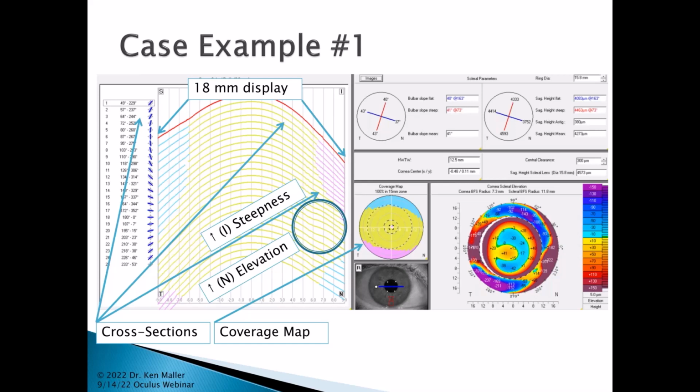And so I took the central scan, which is that golden yellow scan, and then I went ahead and lifted the upper lid to get that turquoise bluish scan in the upper arc, and then I pulled down the lower lid to get that pink arc that's down at the bottom. So this was actually gathered in 3 scans. That is not necessarily needed for this, and I did learn as I was moving forward, which we'll see on the next example.